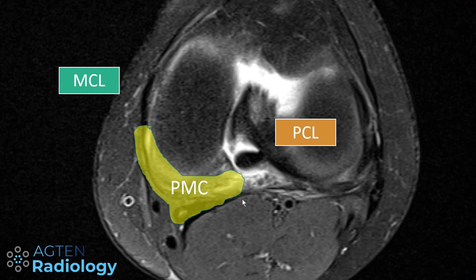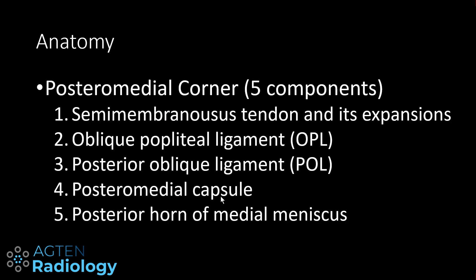In this little corner, there are basically five structures that are frequently named in articles regarding the posterior medial corner. These are: the semimembranosus tendon and all its expansions, then the OPL, also known as the oblique popliteal ligament, then the POL, the posterior oblique ligament — don't ask me why they have these confusing abbreviations — then the posterior medial joint capsule, and obviously the posterior horn of the medial meniscus. So these five structures basically make the posterior medial corner.